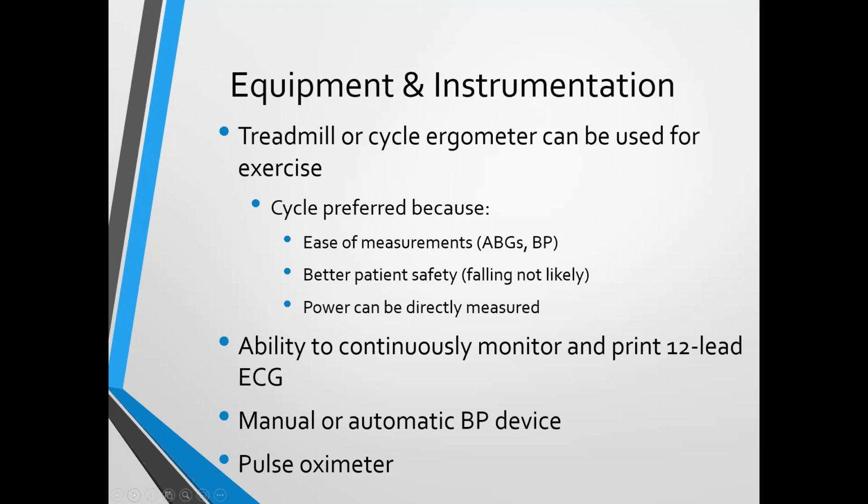We actually have one at the hospital in our PFT lab, just to be clear on that. But on a lot of the floors, it's automated. You put them on, you press the button, boom, it goes up. A pulse oximeter is a must. Those portable pulse oximeters, the little ones, are now like $10, $15. They used to be several hundred. Now they're not, so that's a good thing to have.